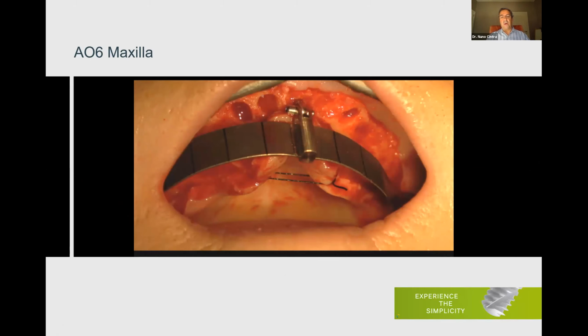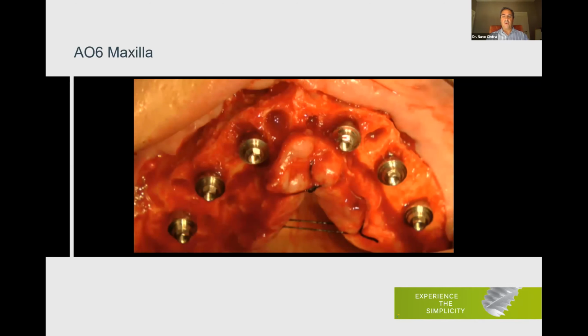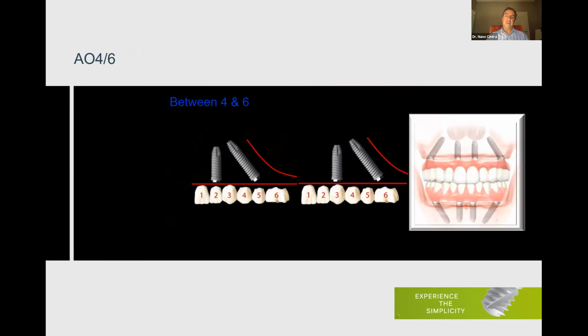Anyway, I also use it for the all-on-6 because I find it convenient and it helps me with the placement of the straight 6 implants, like in this case. 6 implants and the posterior ones are coming out on the 6. So we don't have any cantilever, or we have one tooth in cantilever. Now, when the anterior wall of the sinus comes forward, which are the most frequent cases, then we can think about tilting the posterior implant, and then we go for all-on-4. And we go for all-on-4 if the posterior implant comes out between the 4 and the 6.